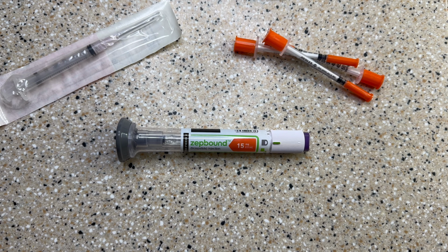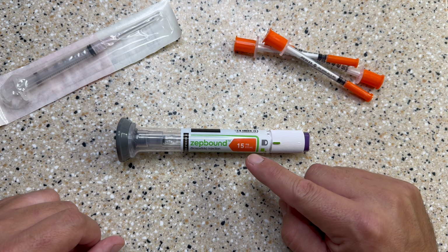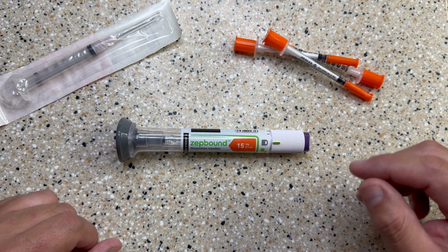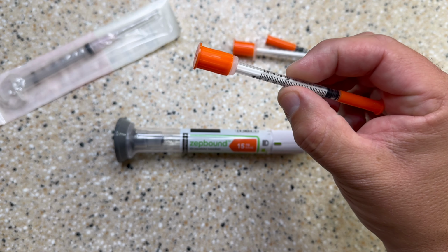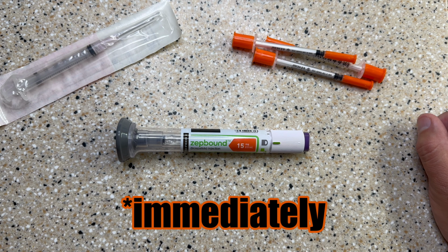Why this is important is these companies charge for the same amount of product, no matter if it's a 5, 10, or a 15 milligram. If you get the 15 and are able to disassemble it and cut that product back, you'll be able to save quite a bit of money in the long run.